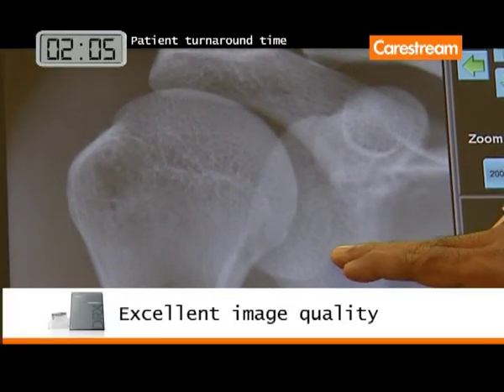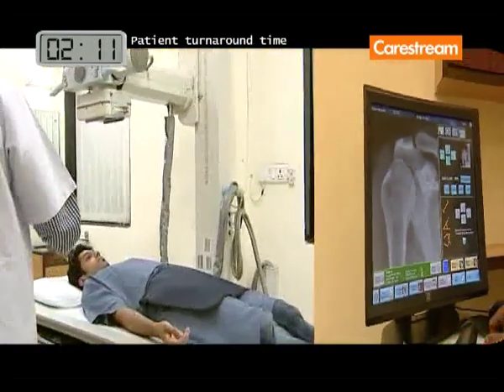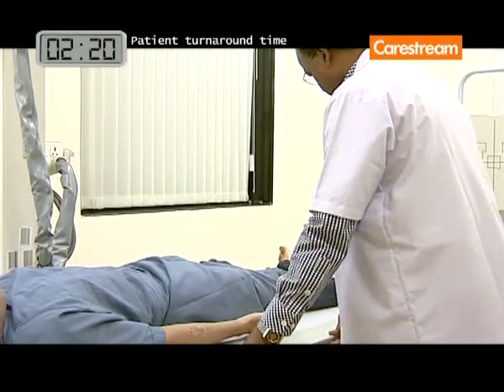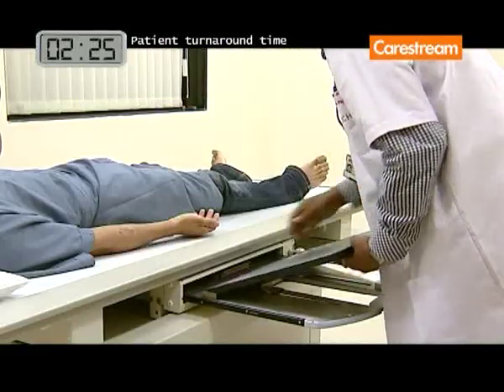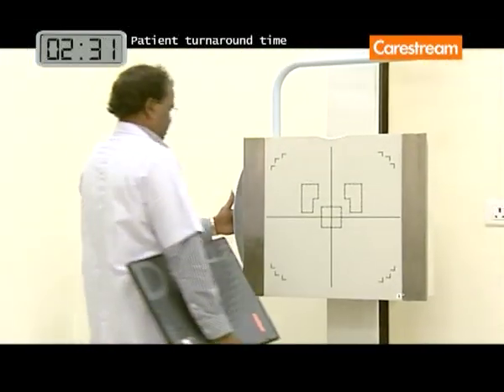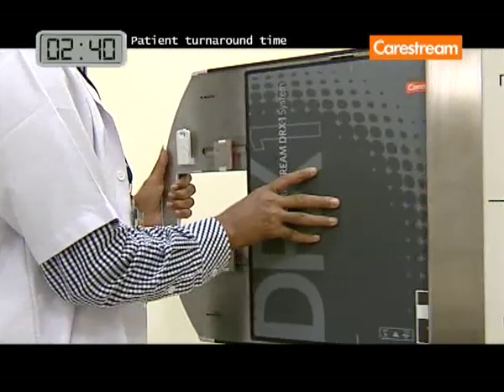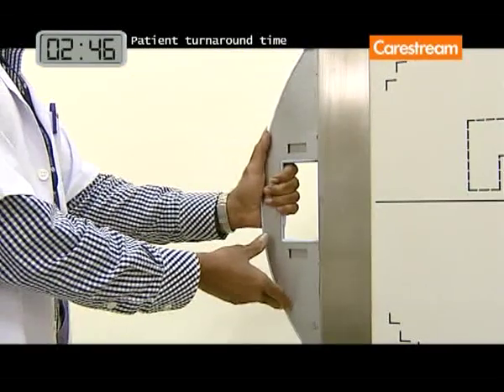Image quality is excellent. The detector's lightweight and wireless operation provides convenient handling and exceptional DR positioning flexibility. The CareStream DRX-1 system is the world's first wireless cassette-sized DR detector.